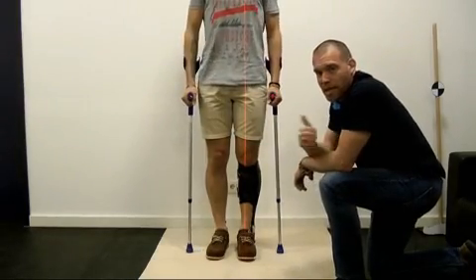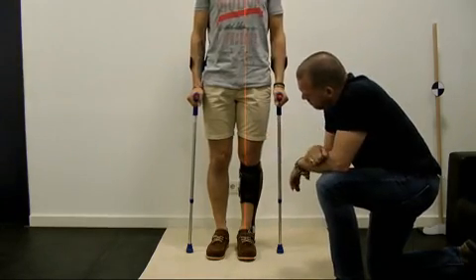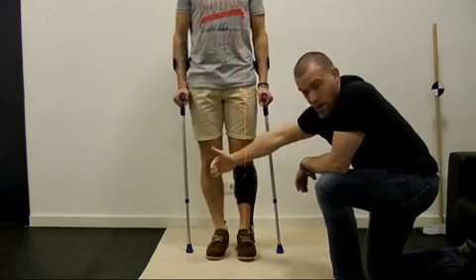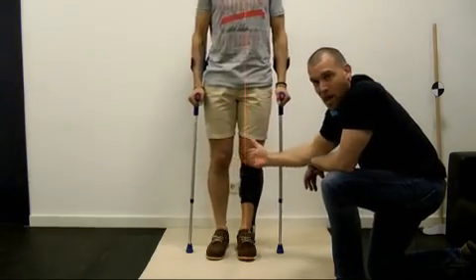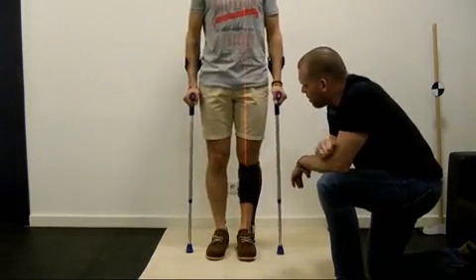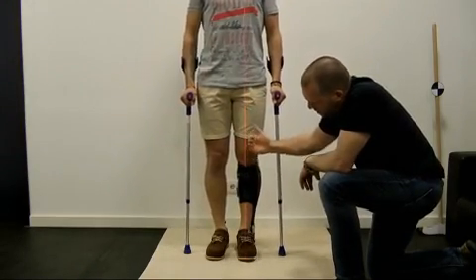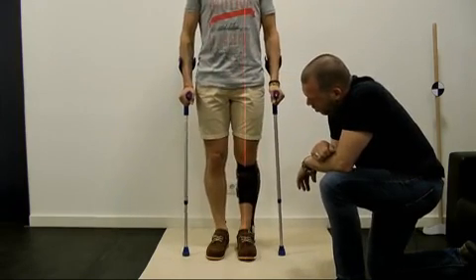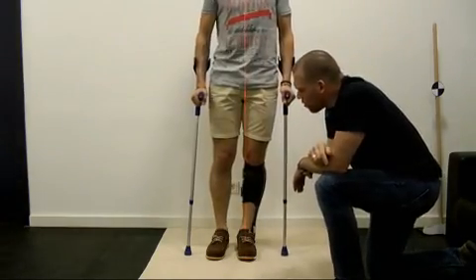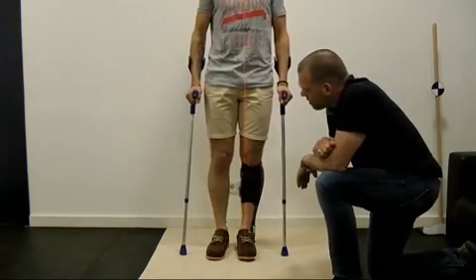Now, looking at him from the front, we should of course check if the patient can transfer the weight from one side to the other, that is, from the contralateral side to the orthosis side and vice versa. Before letting the patient take even one step, it should be checked if the patient is able to put weight on the orthosis and ideally to stand on the orthosis. To test this, it is not necessary to lift the feet from the ground. The patient should simply shift the weight like we are demonstrating here, and this should be sufficient.